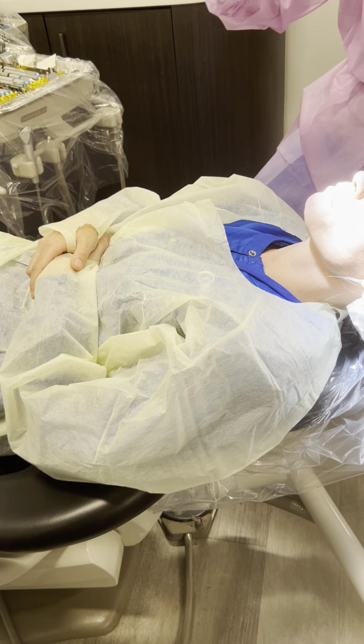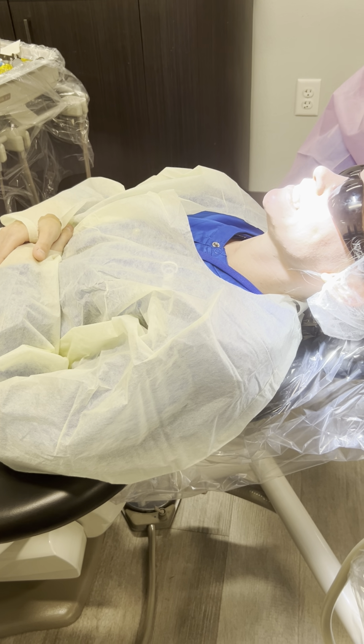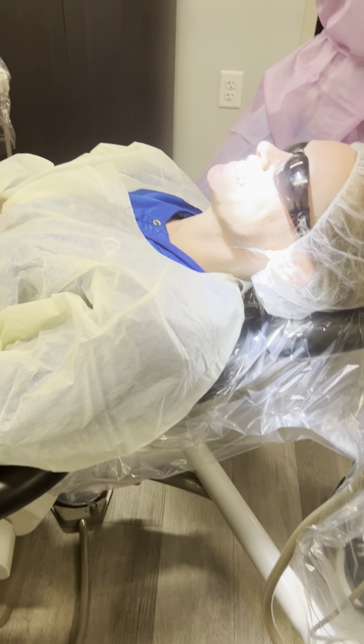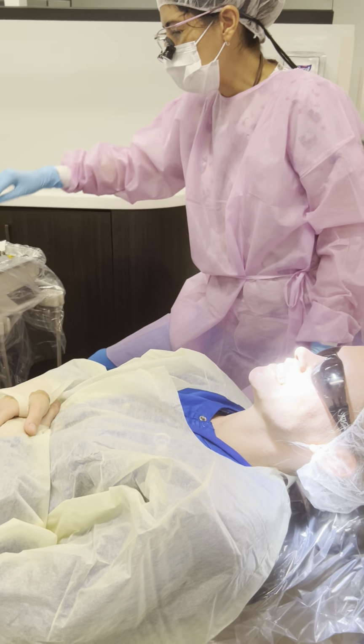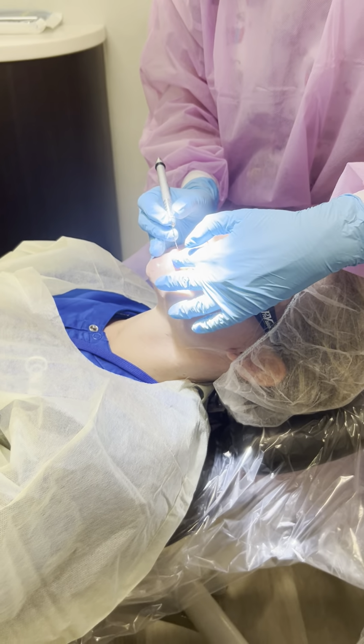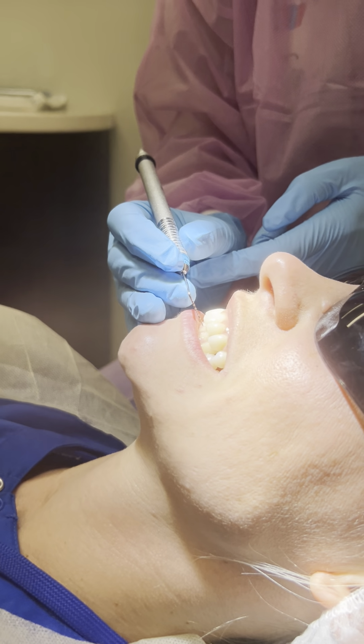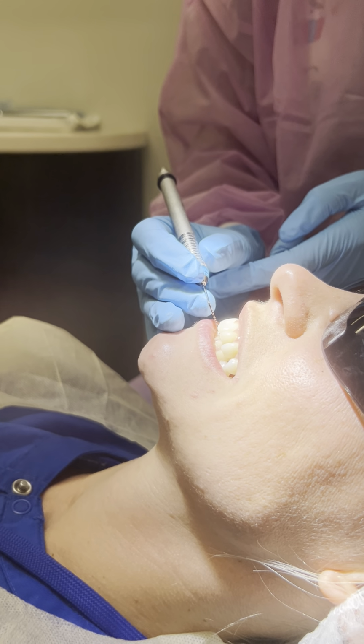So now we're going to check for overjet. Think of JetBlue. The planes are usually traveling horizontally, right? Okay, that makes sense. So that is going to be your overjet, the horizontal measurement. I'm going to come here with the tip of my probe and put it on the facial surface of the mandibular, right there.